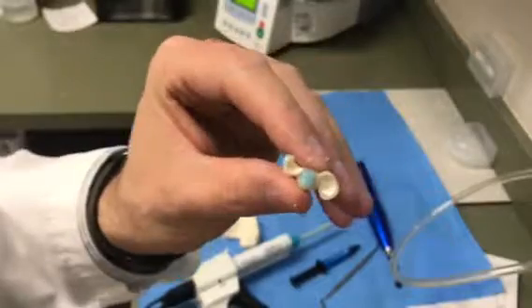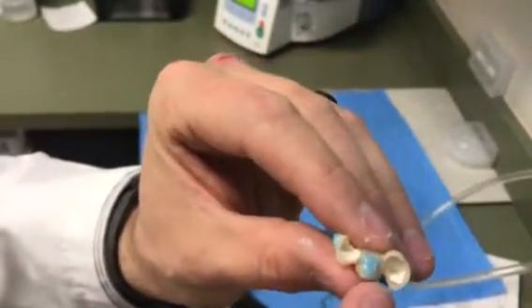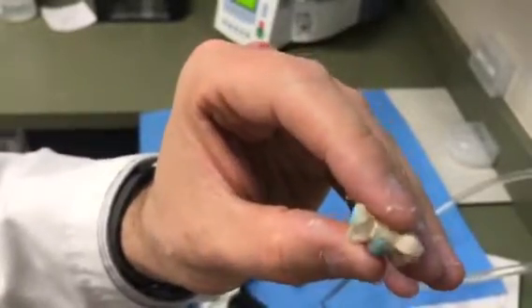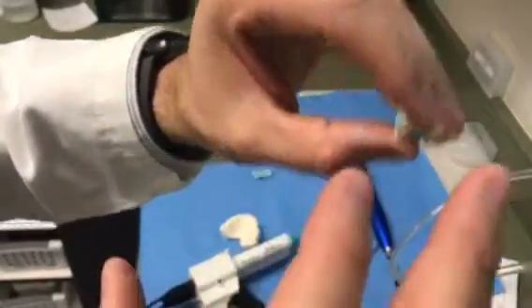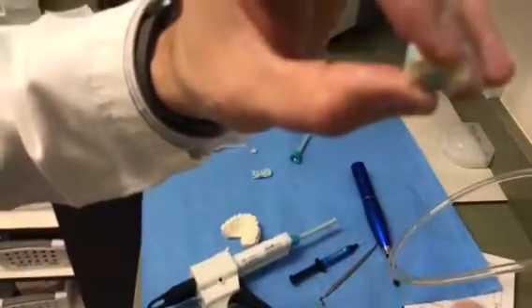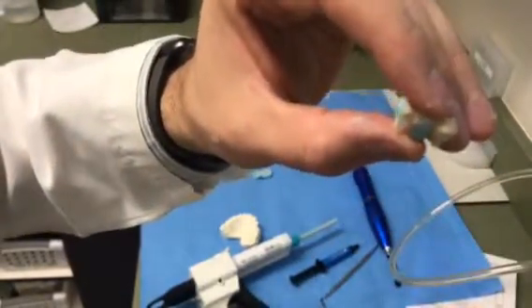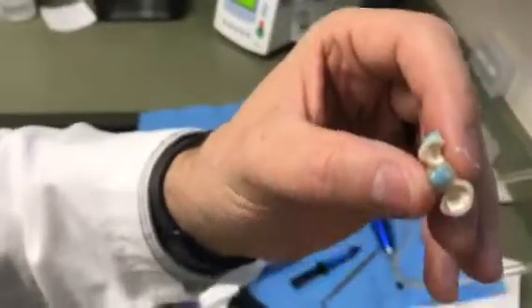So I would add to the Pontic site. Obviously, that's not that pretty. If I was doing this in reality, I would add to the shape and contour a little bit more so that it were nicer. And then I'd try that in the patient's mouth, and usually with my bridges, I want to see that tissue just displace slightly, where it puts just the tiniest amount of pressure in that Pontic site. That way it doesn't have that perfect space for food to slide up under there and get stuck and be a pain in the neck to get out. But again, that's a pretty perfect method for that.